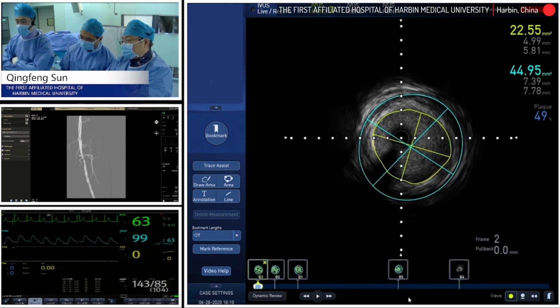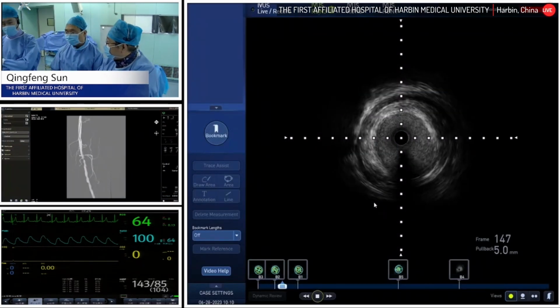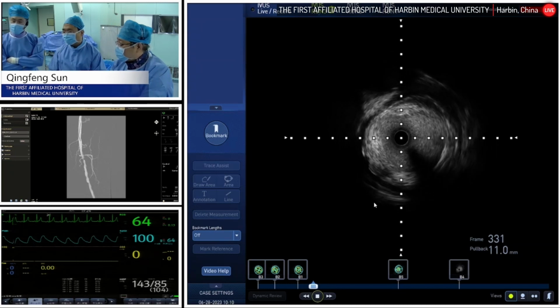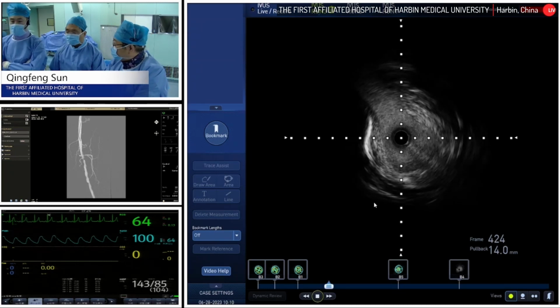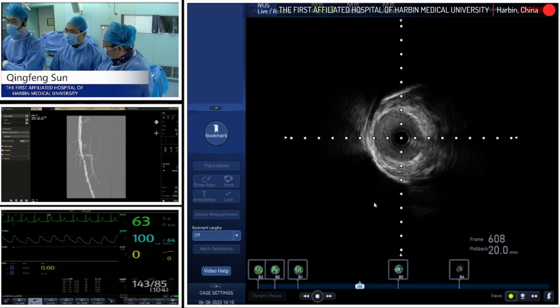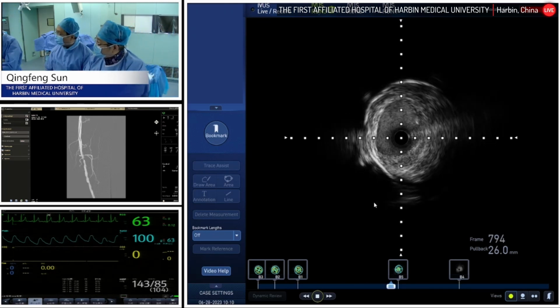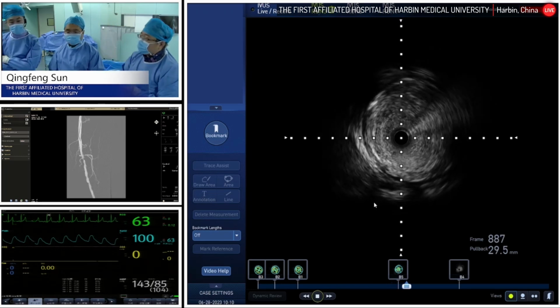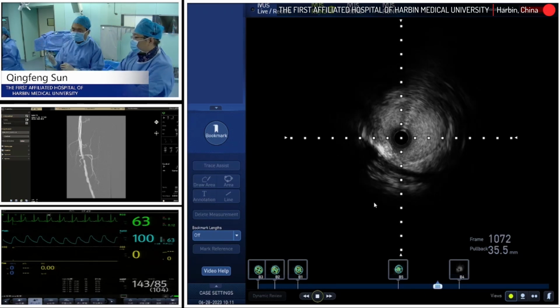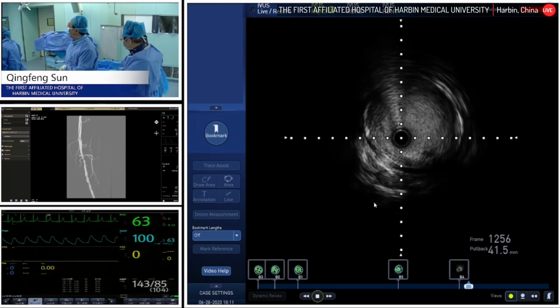Yes. From the graph under the IVUS, we think this is a stenosis with fibrosis. Yes. So we use gradual PTA from 3, 4, 5. Start from the 3, all right? Can we have a 3.0 by 100 Sterling balloon, please?